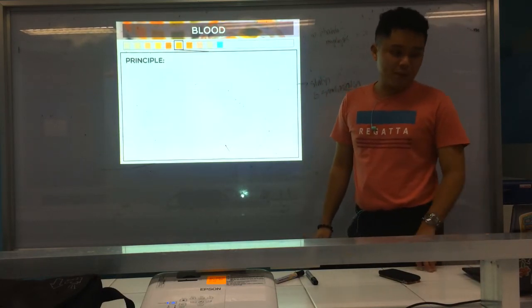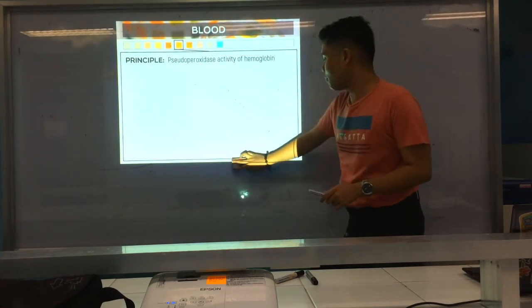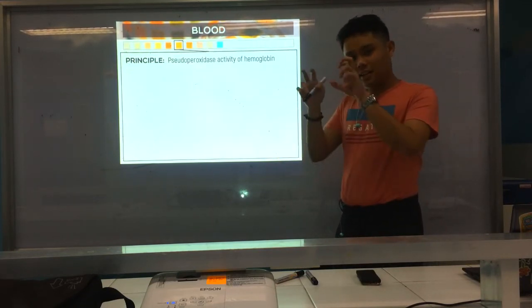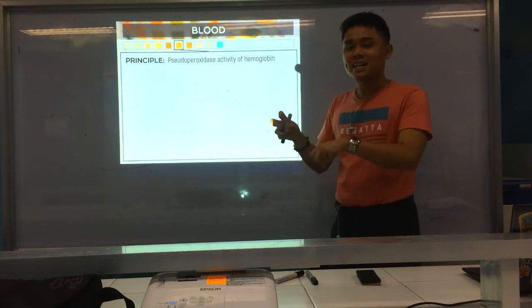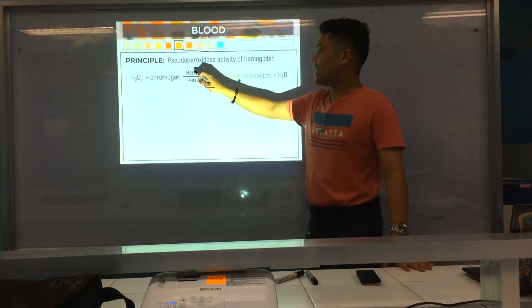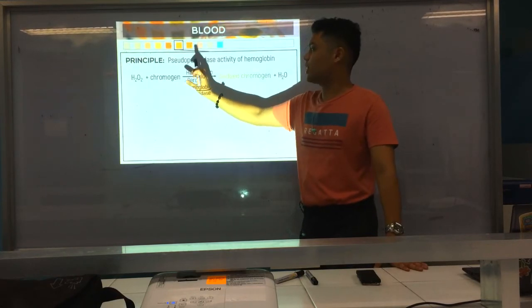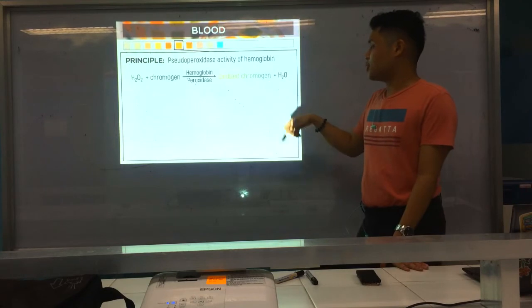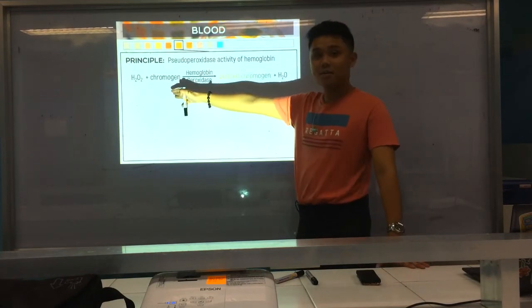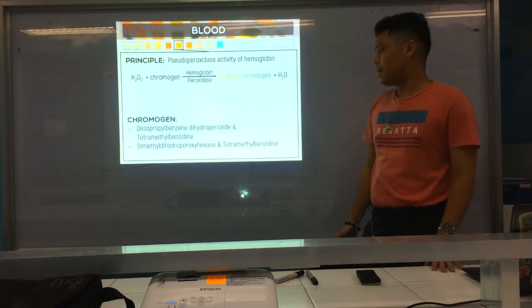Now for blood, the principle is the pseudoperoxidase activity of hemoglobin. Why pseudo? Because it's not really true, but it's close. Hemoglobin is not an enzyme, it's a protein, but it has an enzyme-like activity, a peroxidase-like activity. And that's what we use. With H2O2 and chromogen, the heme oxidizes the chromogen together with H2O2. In the process, everything is converted into an oxidized chromogen and H2O, and this oxidized chromogen is what we detect on the pads. Therefore, the more hemoglobin, the more chromogen is converted. Not only hemoglobin, but also myoglobin. And your chromogen is tetramethylbenzidine. How do I remember it?